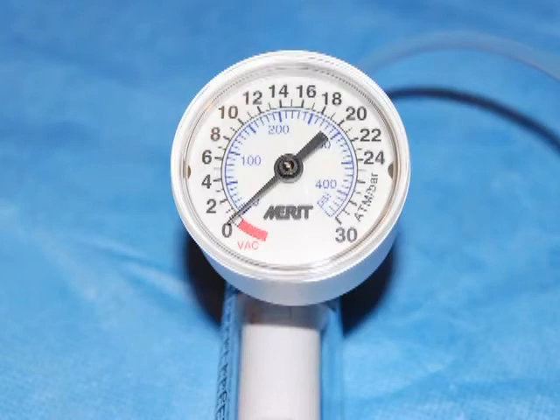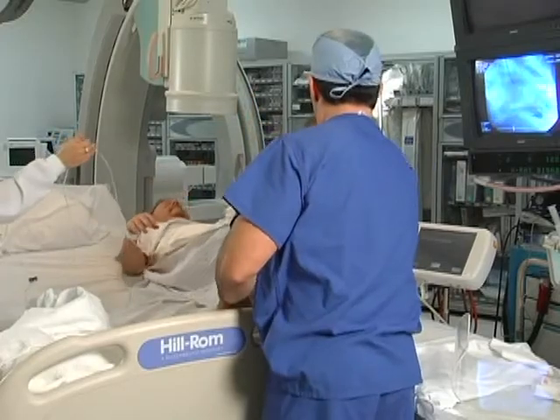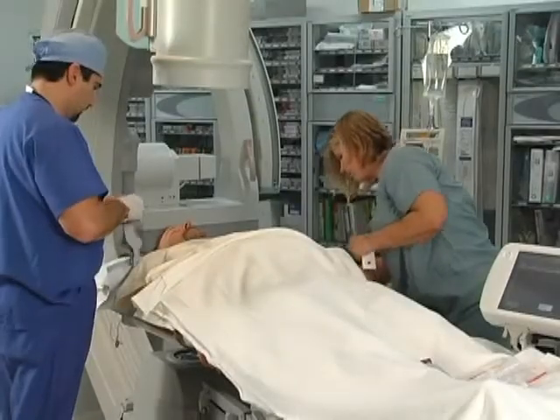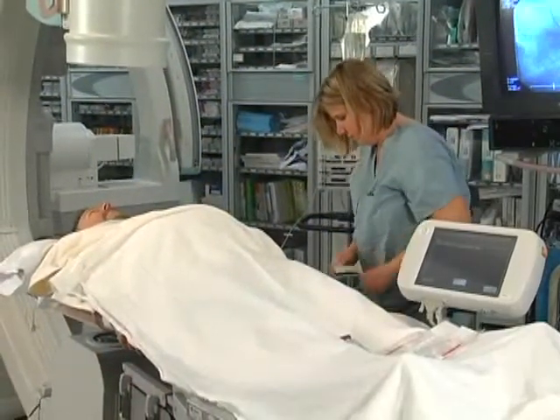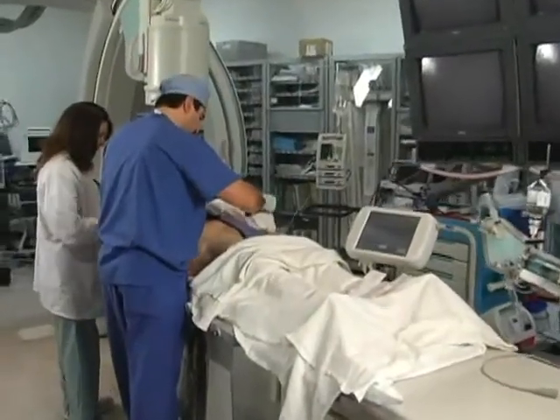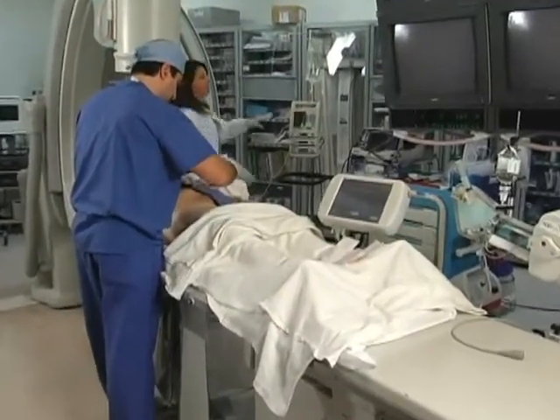The indiflator is designed for quick inflation and quick deflation. The patient enters the cath lab and is transferred to the x-ray table. Nurses then prepare the patient for imaging and vascular access. The electrocardiographic leads are applied to the chest, the patient is checked for a working IV, and emergency equipment is prepared. The groin preparation is then performed for those patients having femoral access. If radial access was planned, both femoral and radial approaches would be prepared.